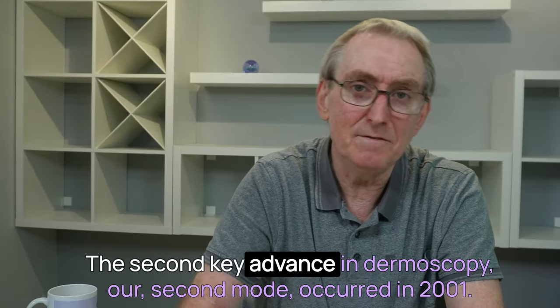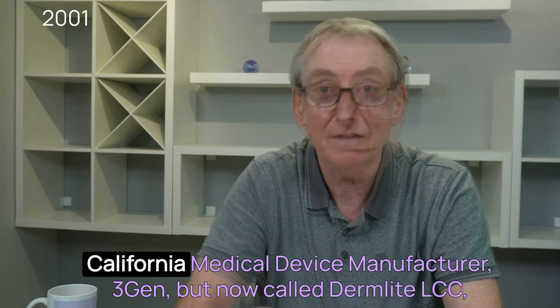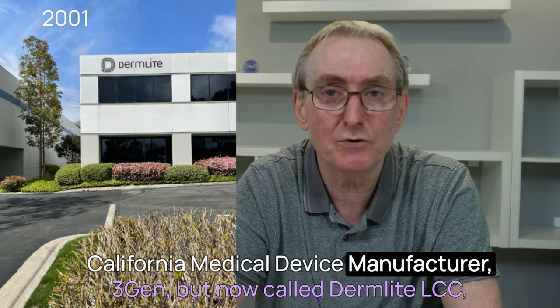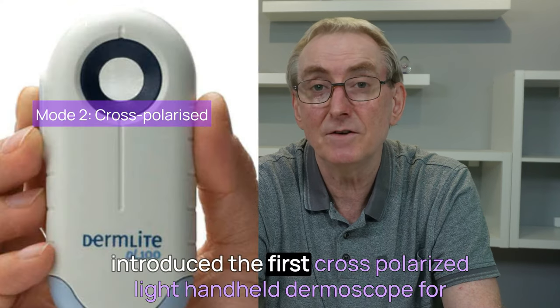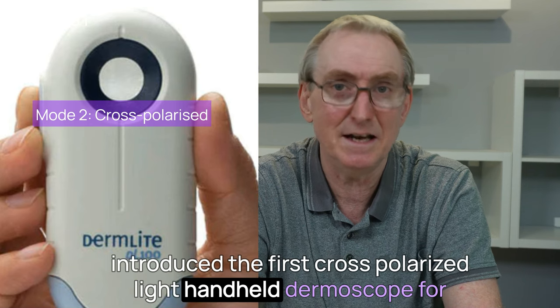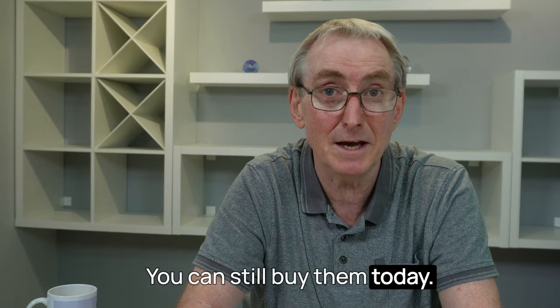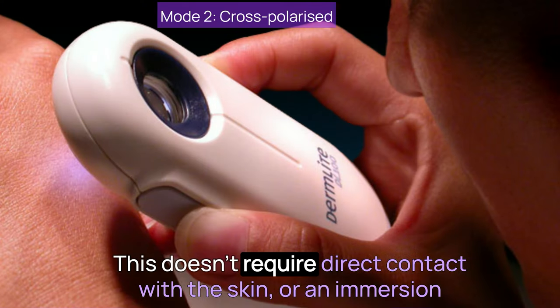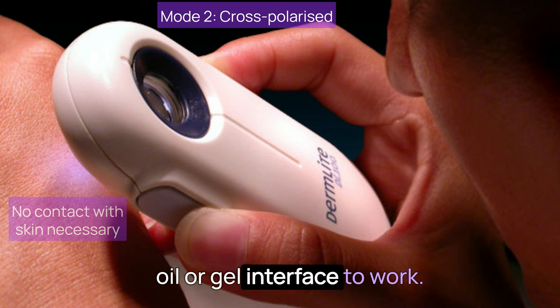The second key advance in dermoscopy — our second mode — occurred in 2001. California medical device manufacturer 3Gen, now called DermLite LLC, introduced the first cross-polarised light handheld dermoscope for general sale: the DermLite DL100. You can still buy them today. This doesn't require direct contact with the skin or an immersion oil or gel interface to work.